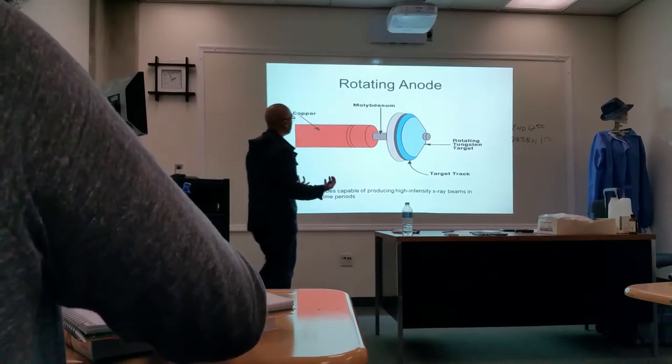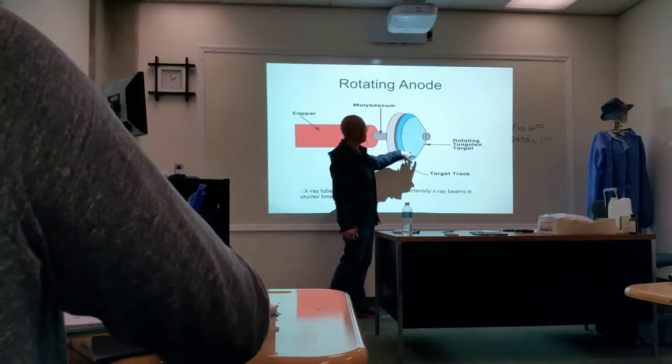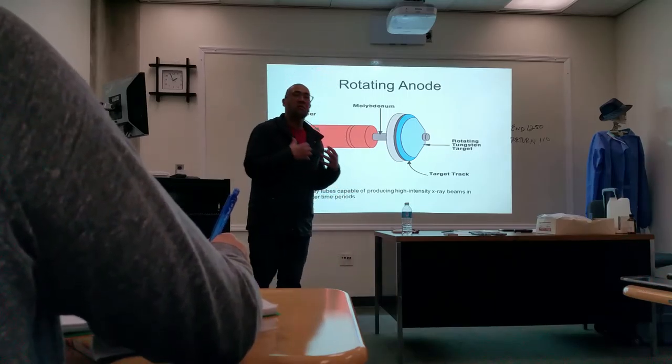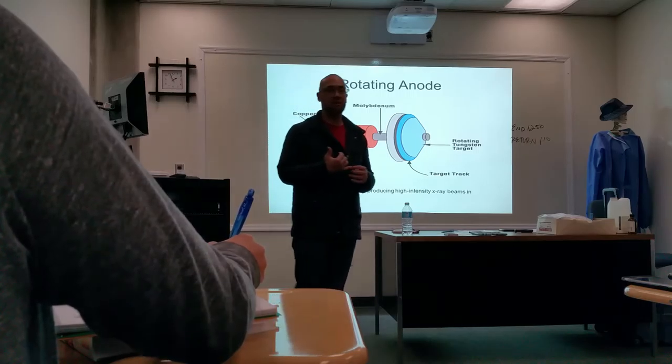So again, you have the same construction. You have a copper block. You have the face of the disc composed of tungsten, but it's also composed of other material for it to be more lightweight and also assist in the dissipation of heat.